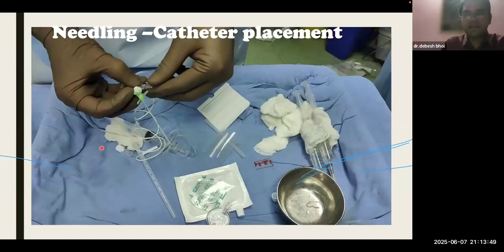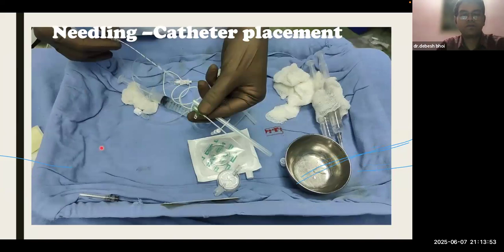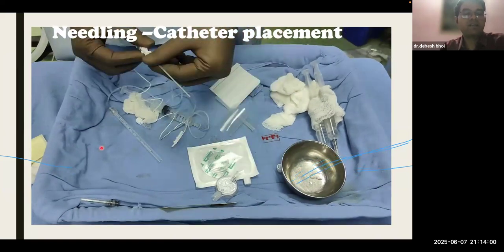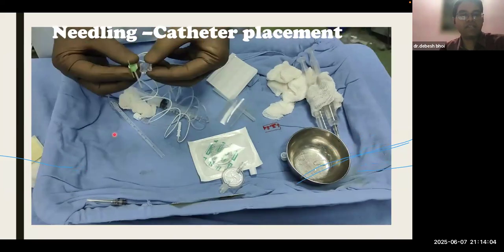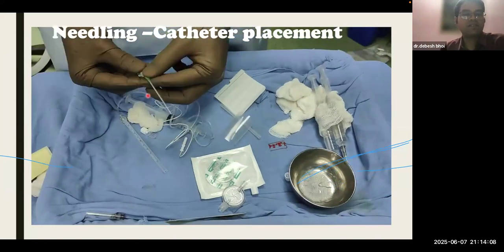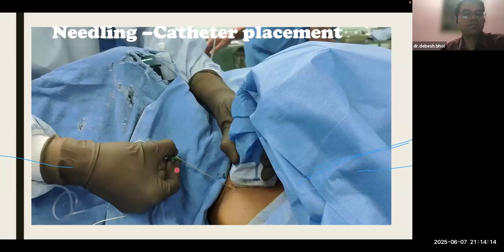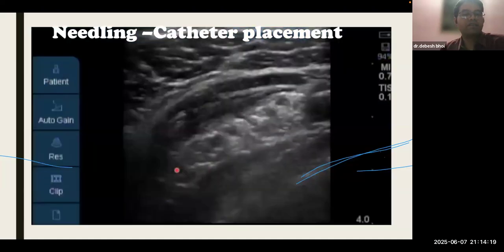So once you identify this, there might be cases of infraclavicular catheter placement. There are case reports of placement of the infraclavicular catheter for pain relief. This is the catheter assembly that can be placed. The needle and the sheath are there. Once you place this, the needle can be taken out and the catheter stays inside, so you don't need to take out the sheath. This is the advantage of this assembly.